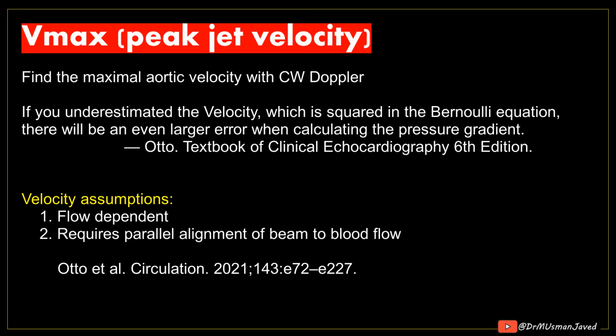And of course, every measurement has caveats and assumptions. When measuring velocity, some of the assumptions include that it is flow dependent and it requires a parallel alignment of the beam to the blood flow.